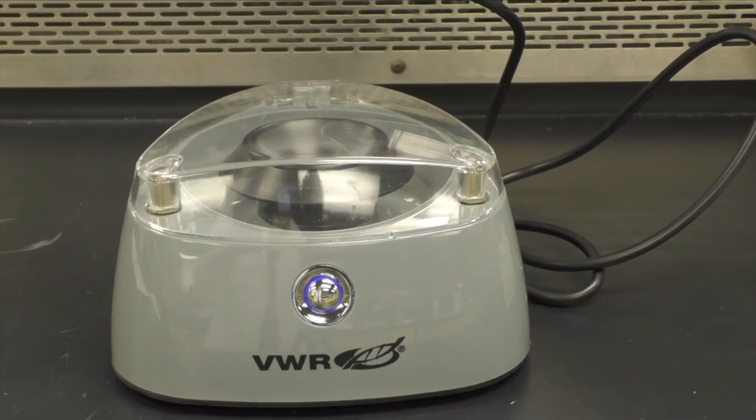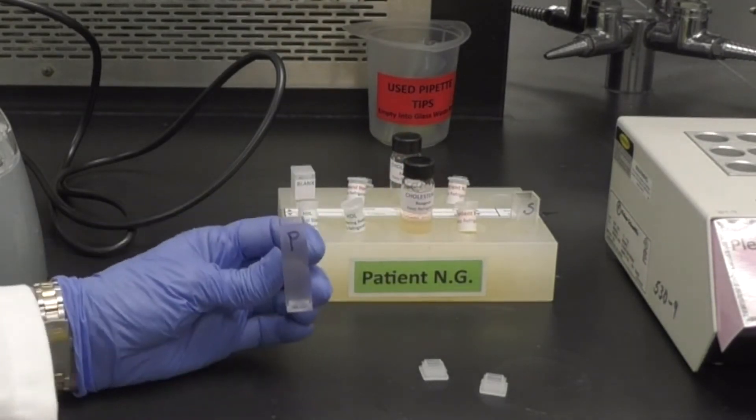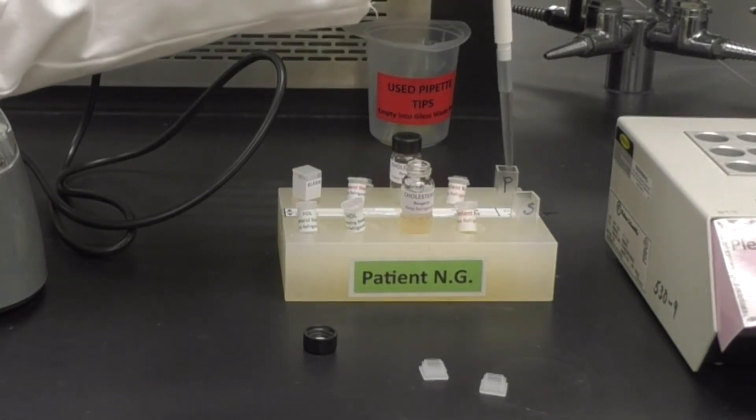Allow the centrifuge to run for 10 minutes. While it is running, label the two remaining cuvettes and micropipette 2 milliliters of cholesterol reagent into each one.